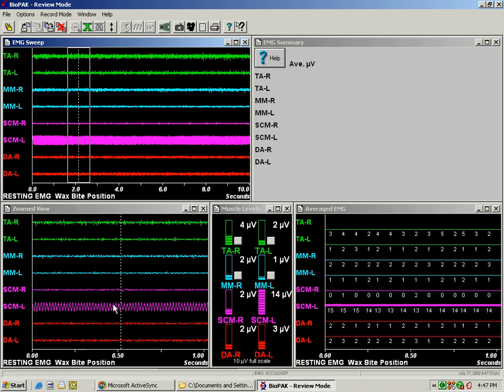United States electrical power runs on a 60 cycle, and most international electrical power runs on a 50 cycle. So from zero to one second we will see that there are actually 60 little spikes here, and if it were taken internationally there would be 50.